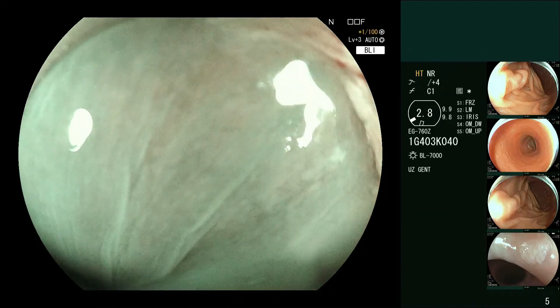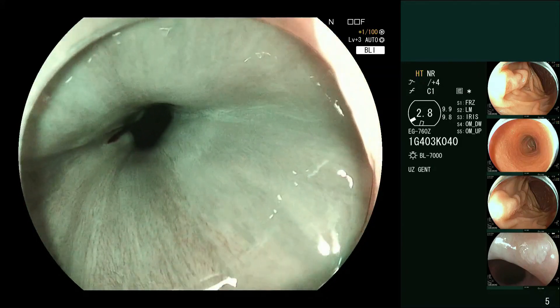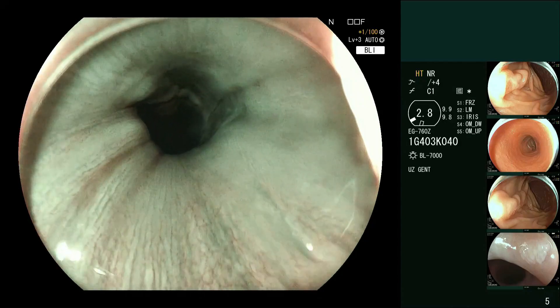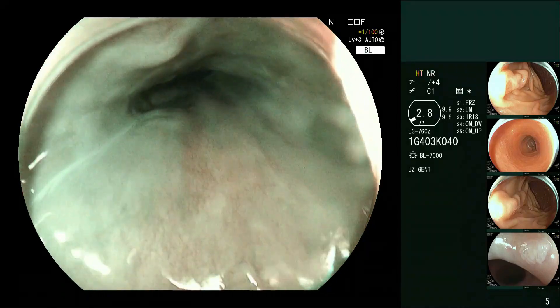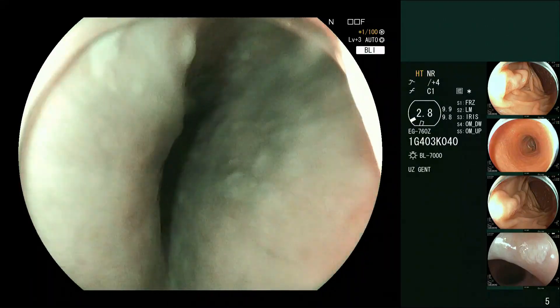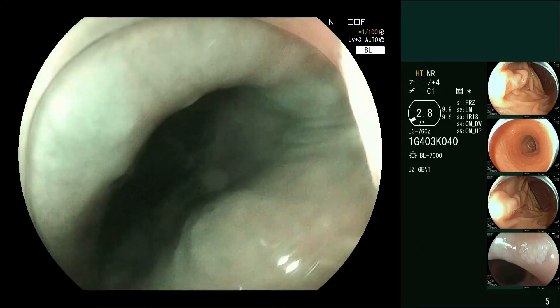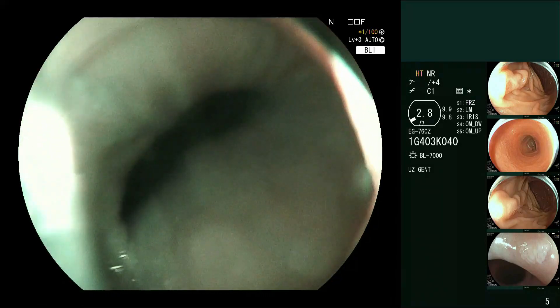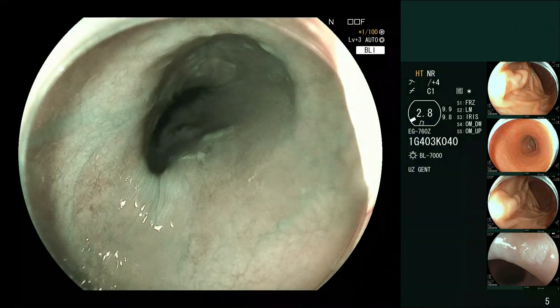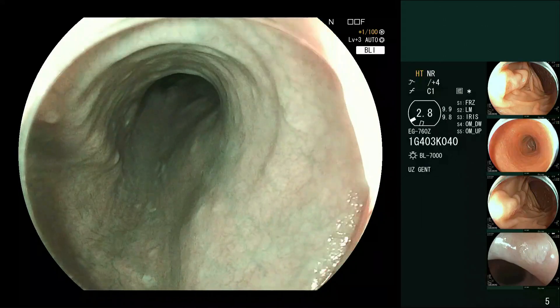Let's get a bit of dirt out of the cap so we're not having that in the image. We come back to the gastroesophageal junction and then withdraw the endoscope slowly — no zoom, a bit of insufflation — up the esophagus. This will help you detect little flat areas. When you get to the mid-esophagus, around 30 cm, you need to be on the lookout for flat squamous dysplasia, because this is where you can intervene to prevent squamous cancer after gastroscopy — one of the causes of post-endoscopy upper GI cancer.